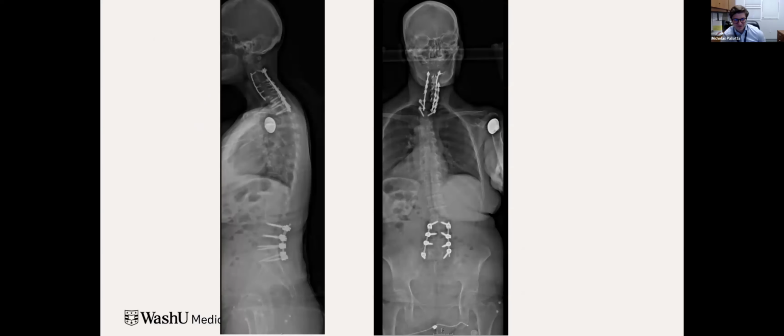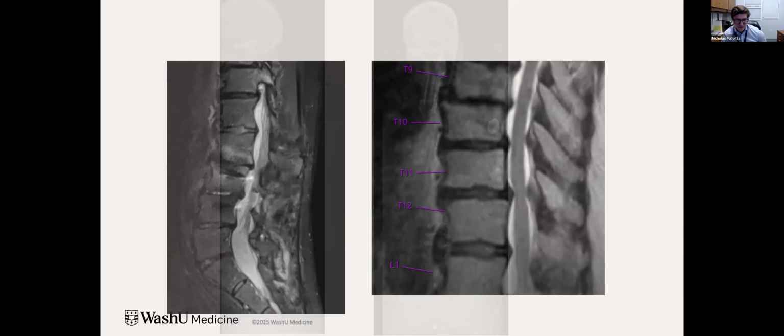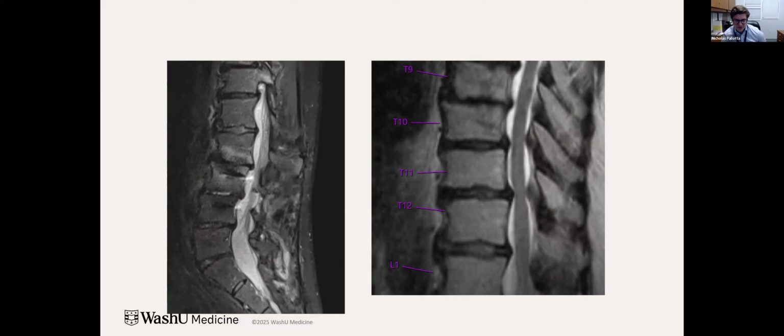You can see this patient had the fusion. You can see some proximal junctional changes at L2, L3. You can see the old C3 to T3 fusion she had, I think it was 20 years ago. Not by me. I'm not that old. Not yet. And the scoliosis she has, and you can see the proximal stenosis, but she also had stenosis, which was quite significant at T11, T12.